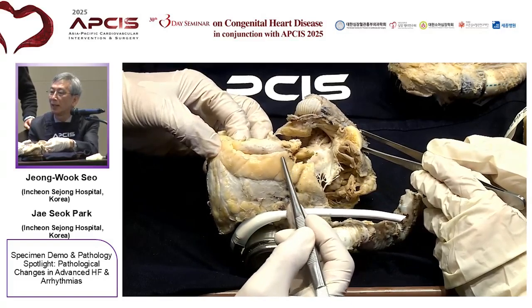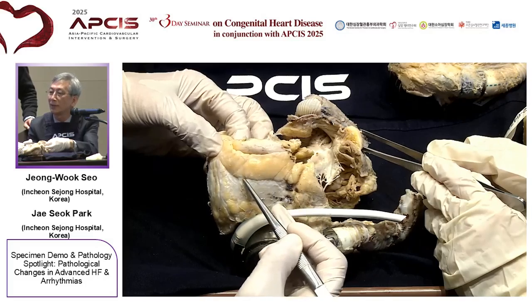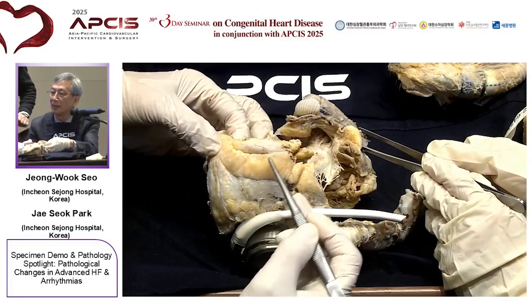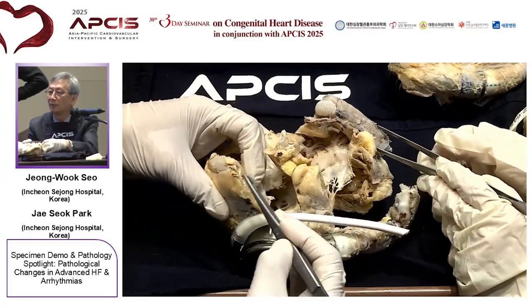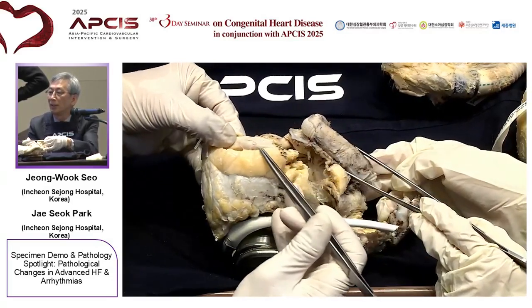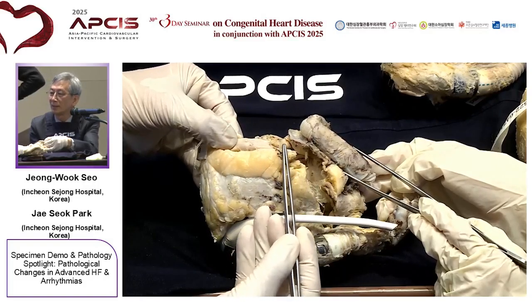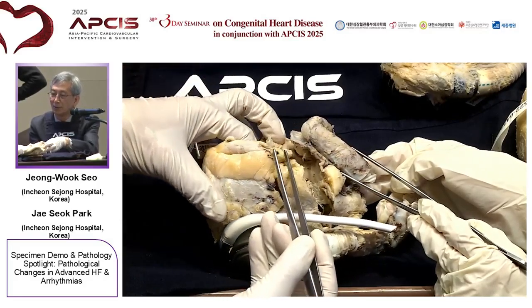So I think he tried to find somewhere here, but not very good. There is a significant big cardiac vein in this area, but he had to come to this area. So the reason he failed to place the CRT lead was the anatomy of this particular patient. The cardiac vein is a little distant from the origin of the coronary sinus orifice.